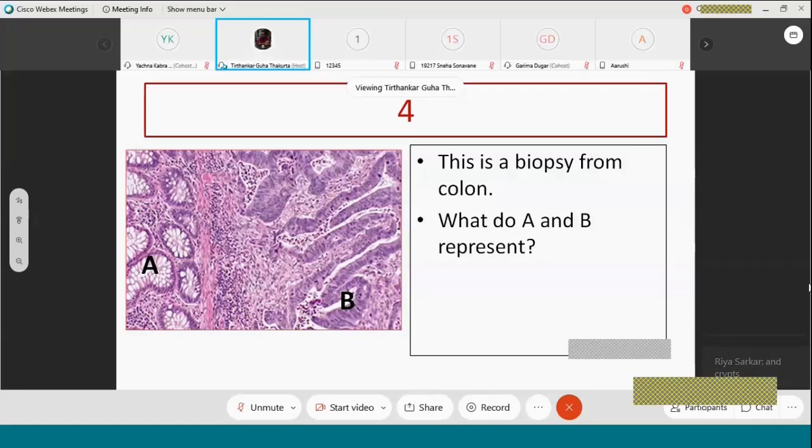Also see carefully, there are dark violet dots indicating increased mitosis in the cells. So it is probably a malignant gland or adenocarcinoma. So on one side you are getting benign or normal glands, and on the other side malignant glands with increased mitotic activity. These violet dots are mitoses. You do not get such a high level of mitosis normally. Also cells are looking extremely basophilic. So that is why probably you are dealing with an adenocarcinoma.